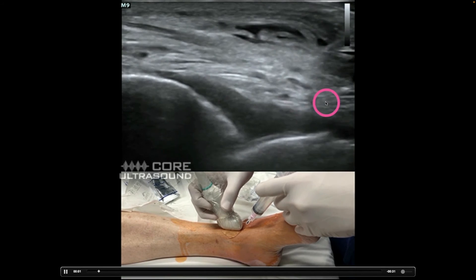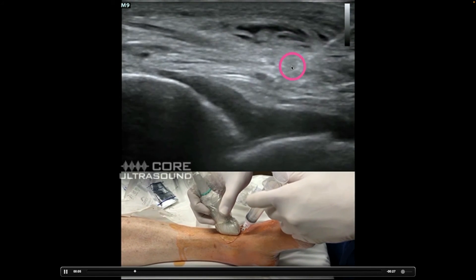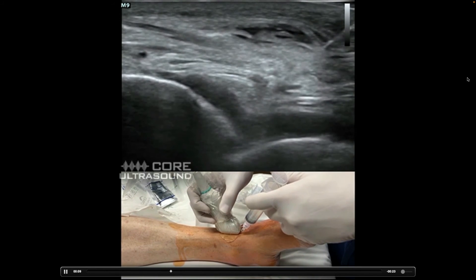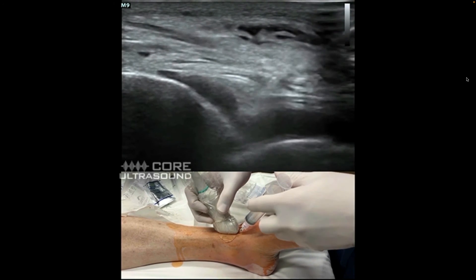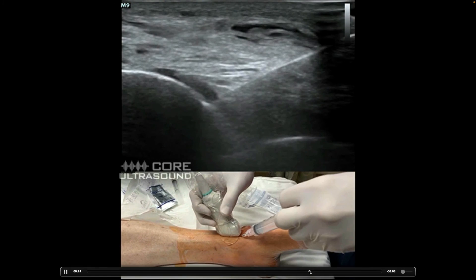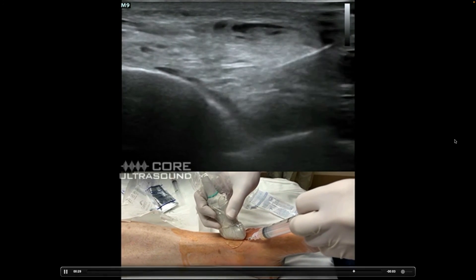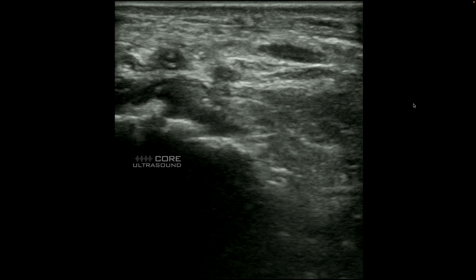Just to show you what it can look like — this fluid is from the lidocaine that was injected. You can see the needle coming in, approaching that joint space, getting inside and aspirating what was, fortunately for this patient, not infected fluid inside that joint. You can see here that I am aspirating some straw-colored aspirate, and we sent it out to the lab and they confirmed that it was an inflammatory effusion.